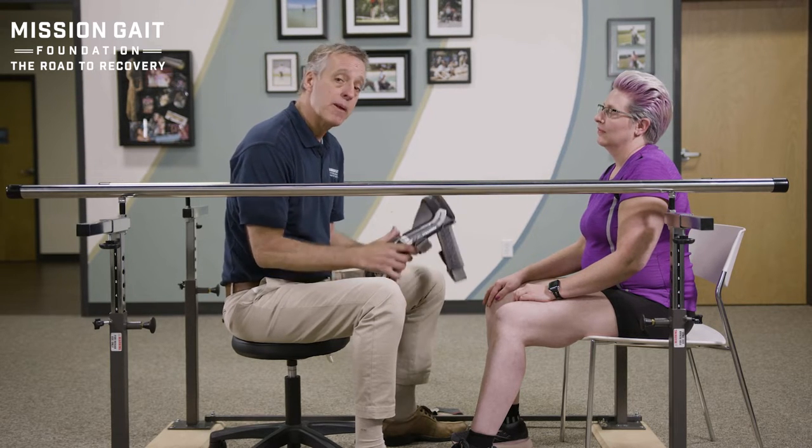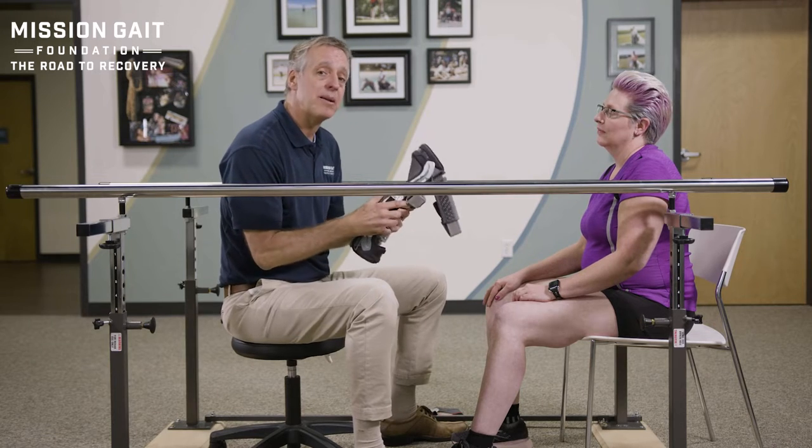Hi, I'm David Lawrence, CEO and founder of the Mission Gate Foundation. In this video we're going to be talking about fitting a sleeve or brace to the ankle or the knee area. In particular right now we're talking about the knee brace.